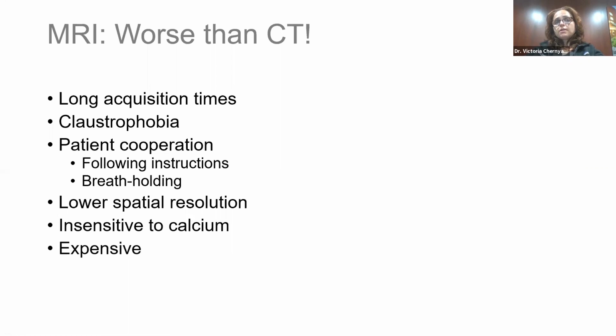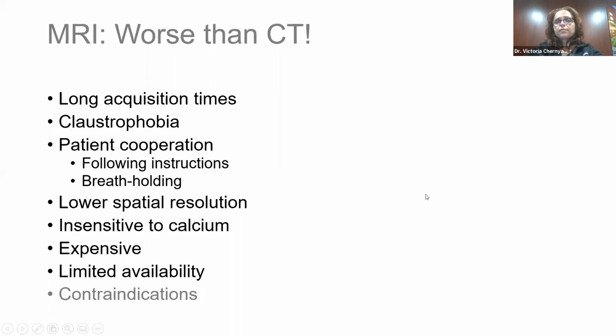Another important thing is that MRI is much, much more expensive than CT. And it's not a non-important consideration when thinking about the healthcare expenditure. And finally, MRI is much less available than CT. Partially because of expense and partially because MR studies take so long, the throughput of the scanner is not nearly what the CT does. So it's much easier to get CT than MRI.